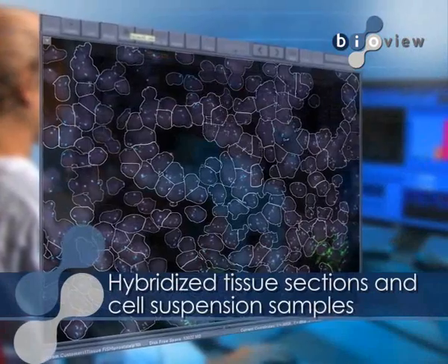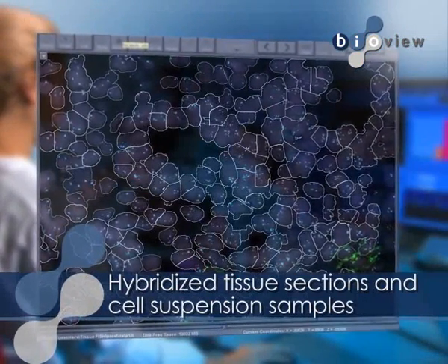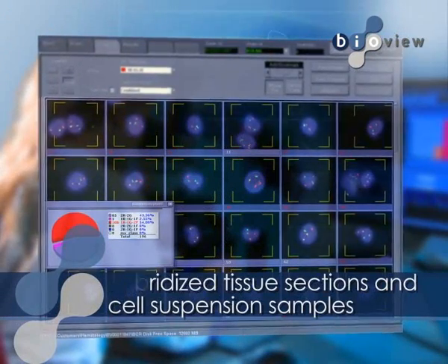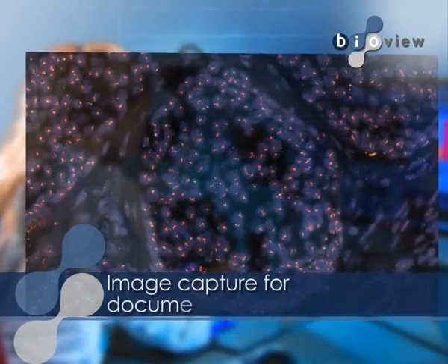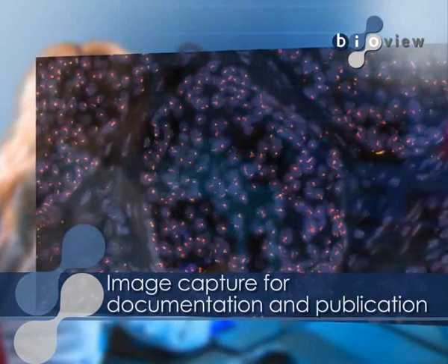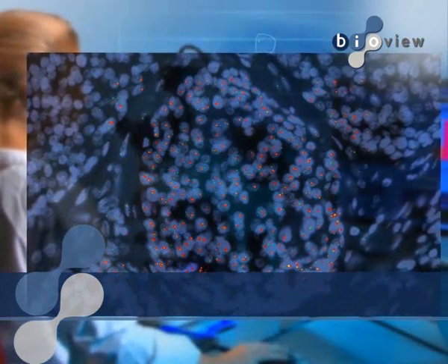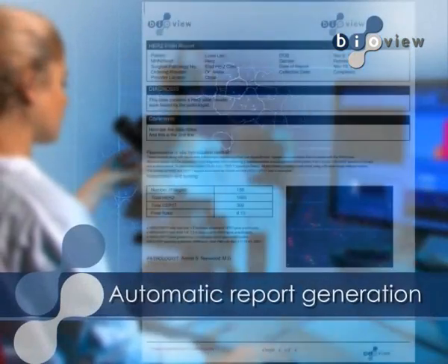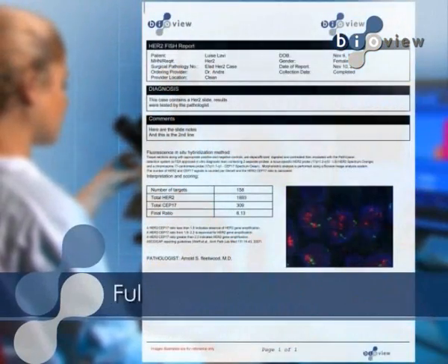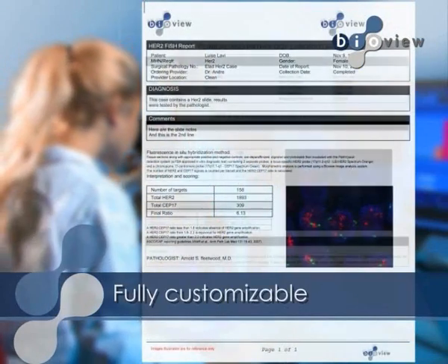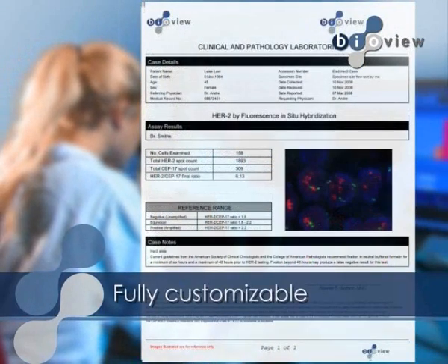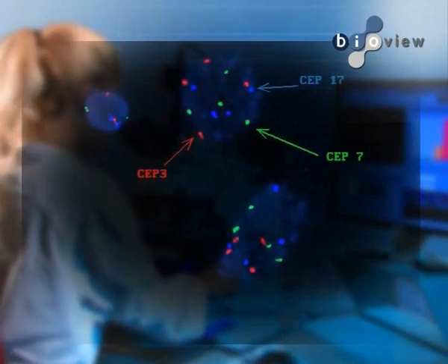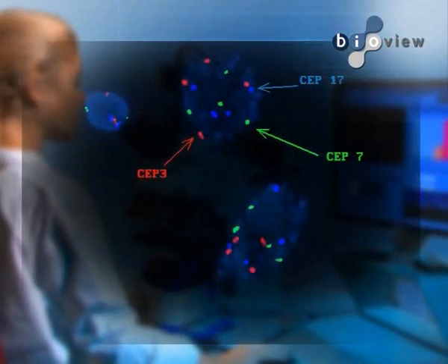Legato enables the automatic analysis of hybridized tissue sections, cell suspension samples, image capture for documentation, publication, and digital archiving of patient cases. Automatically generated customized reports can be distributed in HTML and PDF formats for ease of printing, mailing, or archiving. Image enhancement capabilities allow for export and integration of captured data to the report.